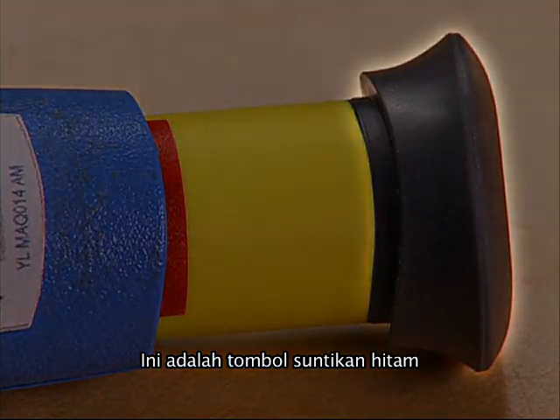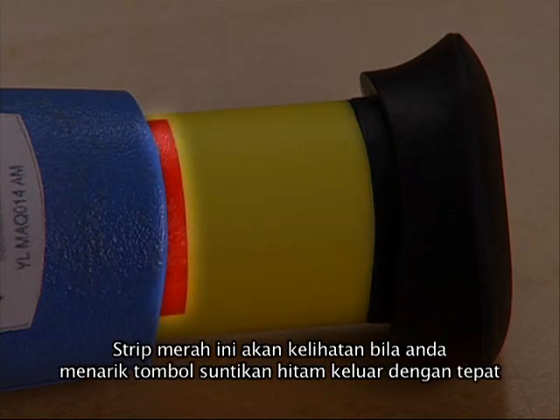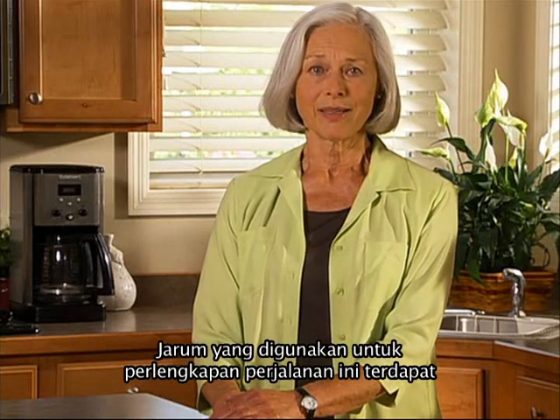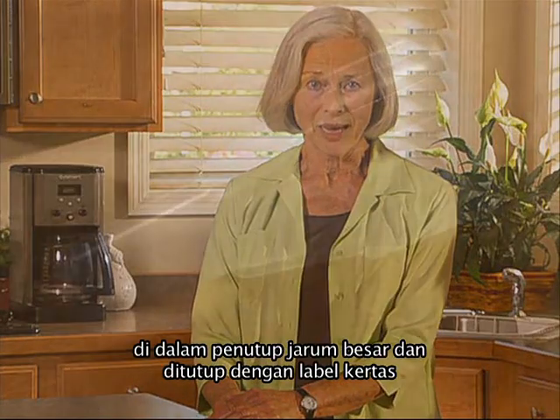This is the black injection button. This is the yellow shaft that appears when you pull out the black injection button. This red stripe will appear when you pull out the black injection button correctly. The needle used with this delivery device is contained within a large needle cover and sealed with a paper tab.